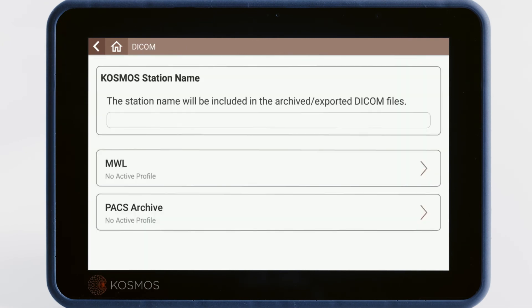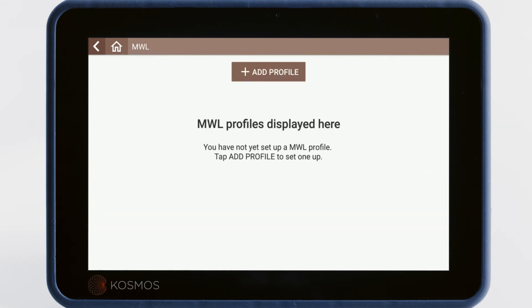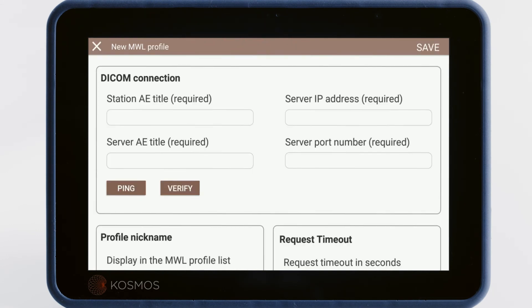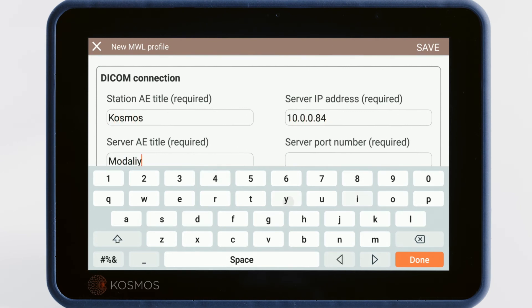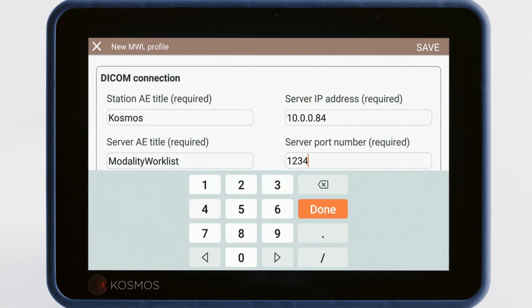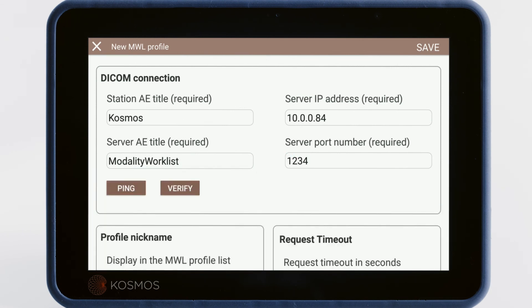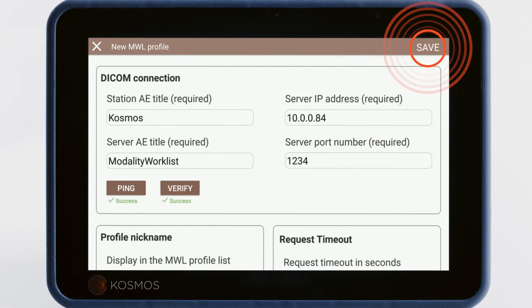Setting up the MWL follows a similar process. From the DICOM menu, tap MWL, which stands for Modality Worklist. Tap the plus sign to add a new MWL profile. This will bring you to a form where you can add the station AE title, the server IP address, the server AE title, and server port number. Once the form is complete, tap Ping and Verify to check the connection to the server, then tap the Save button on the top right of the screen.